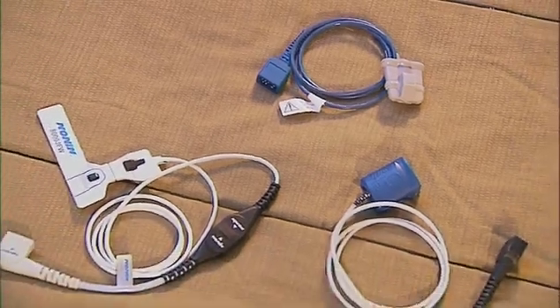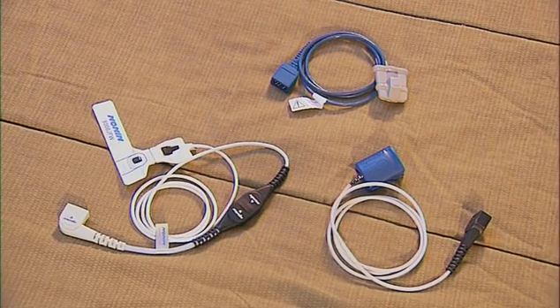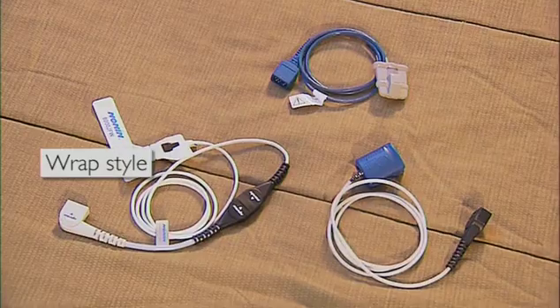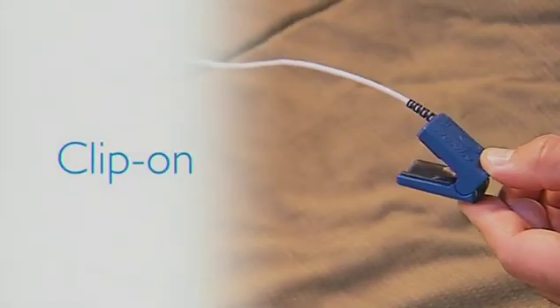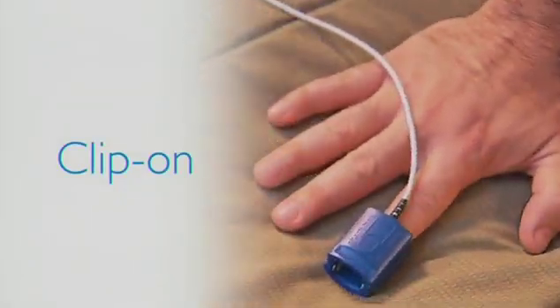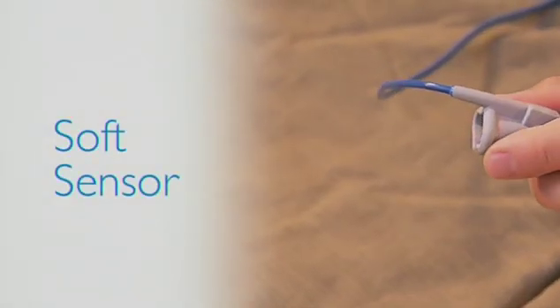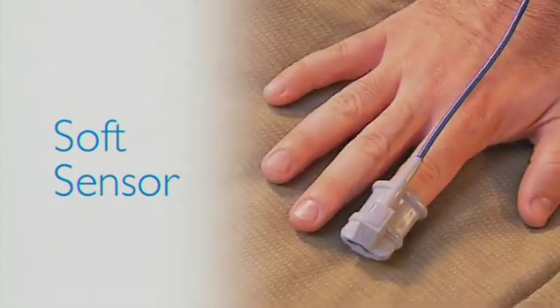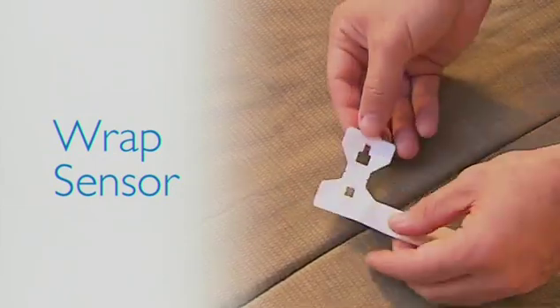Now it is time to attach the SpO2 sensor to your index finger. Your provider may have included one of three types of sensors: a clip-on style, a soft sensor, or a wrap-style sensor. For the clip-style sensor, hold the end of the sensor and squeeze it open so you can insert your finger. For the soft sensor, lightly squeeze the sides open so you can insert your finger.